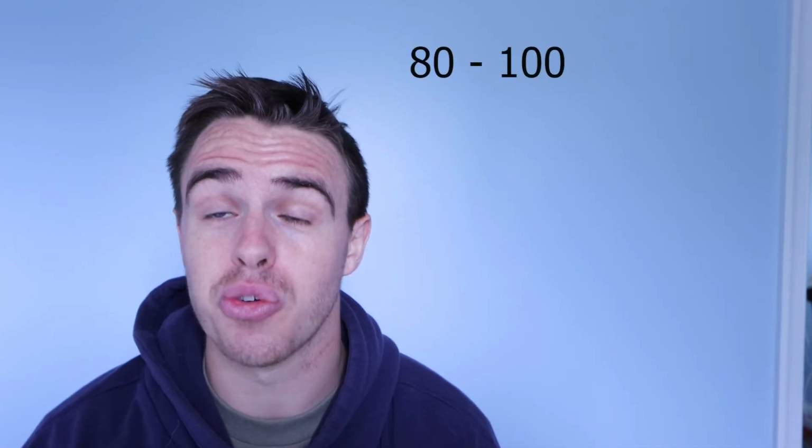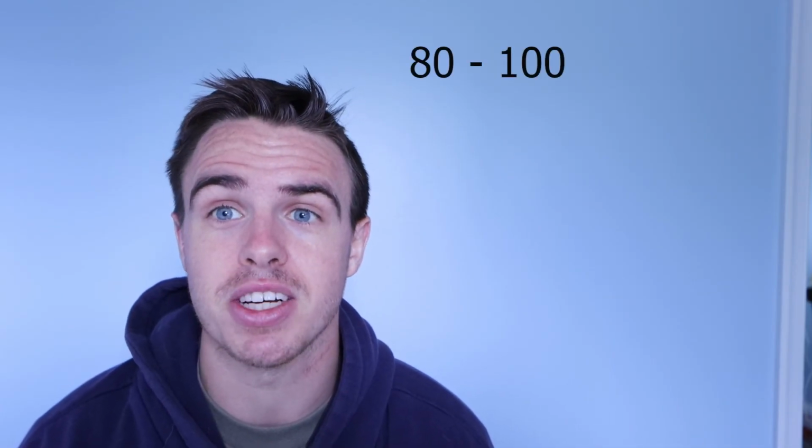So if it is 400, obviously take me off some of the oxygen and bring me back down to like 100. If it's extremely low, put some oxygen on me because my sats are probably not that high either. So for a healthy individual, you want the partial pressure of oxygen to be anywhere from 80 to 100. Anything less than that is abnormal. Anything above that is abnormal. It's okay to be a little abnormal, however, you don't want it to be too high.